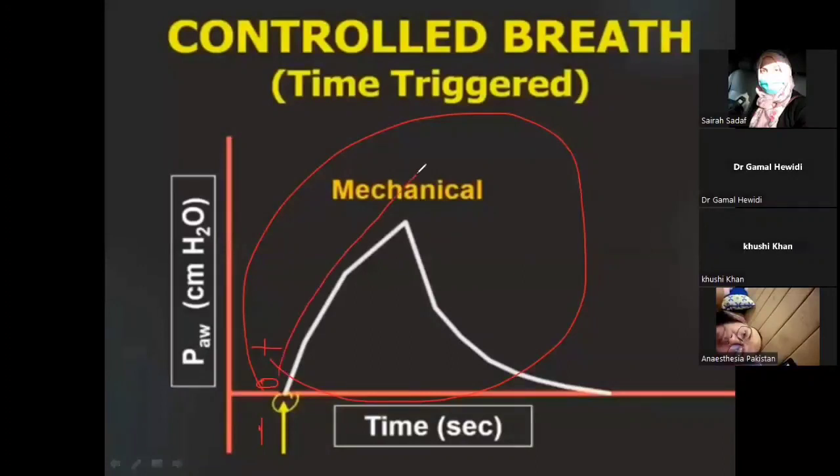So it will go here. And after reaching the maximum during inspiration, it will go for expiration. During expiration, it will fall down to 0 again. Okay? Yes, it's positive. So this is the mechanical breath.